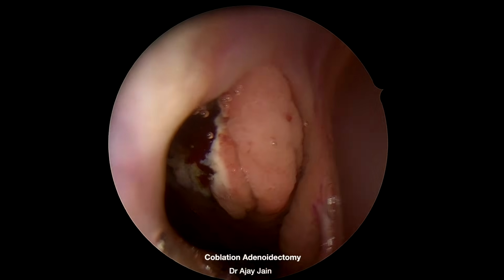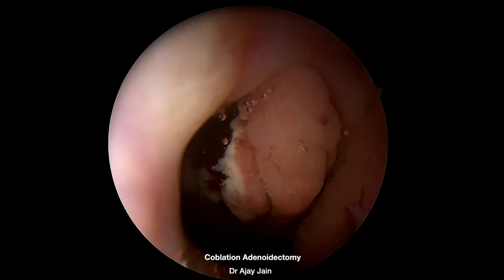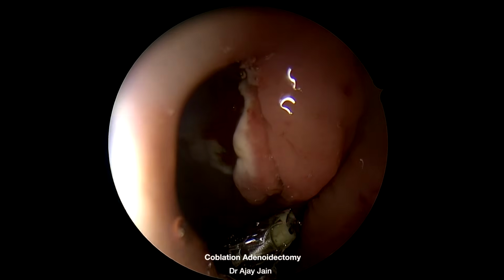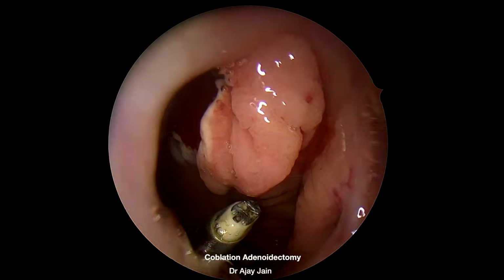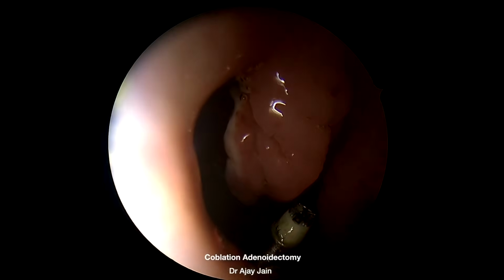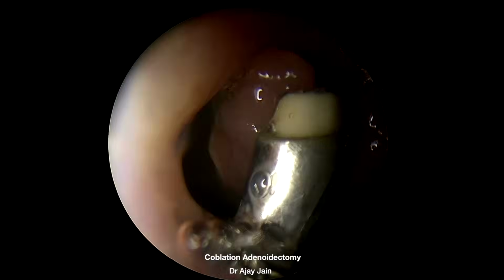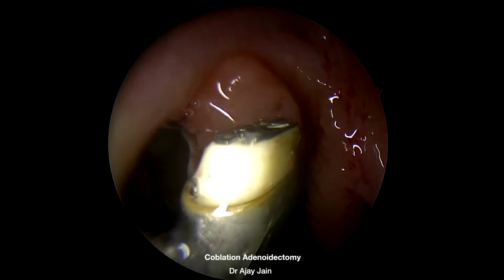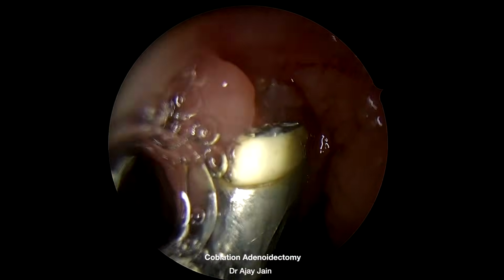Now the remaining adenoid tissue on the left side is removed under direct vision. Note that the bulk has been reduced. The wand can easily reach the roof of the nasopharynx, allowing complete clearance from superior to inferior. Good irrigation combined with effective suction is the key to successful coblation surgery. Notice the absence of significant bleeding, smoke or tissue charring.